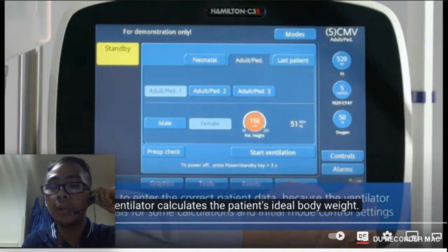If you recall the tidal volume part of the ventilator management lesson, it is very important to determine if the patient has ARDS, COPD, asthma, or is a normal patient.